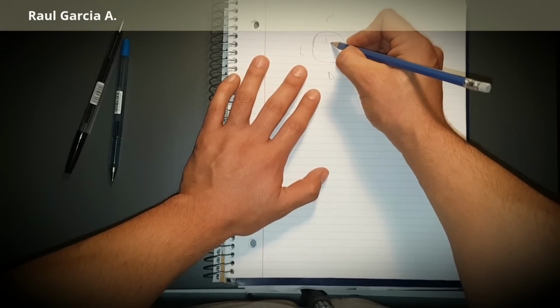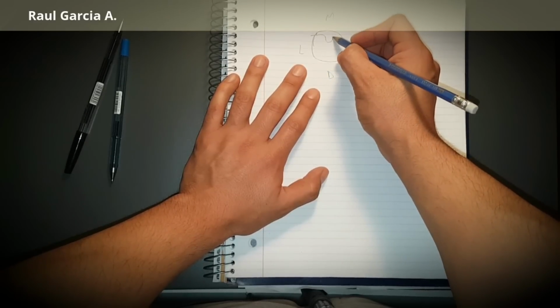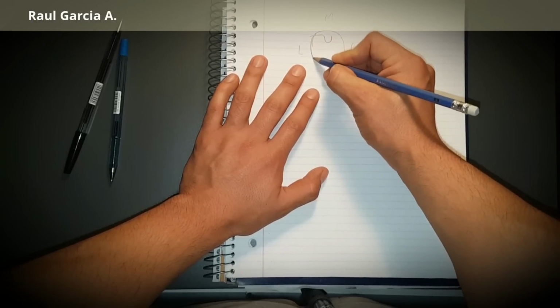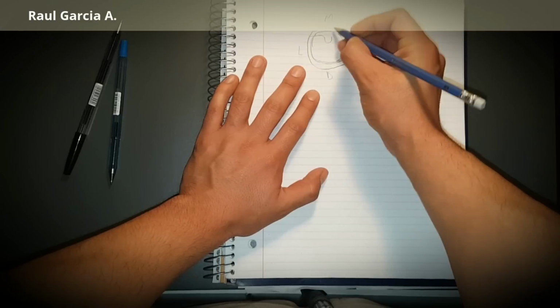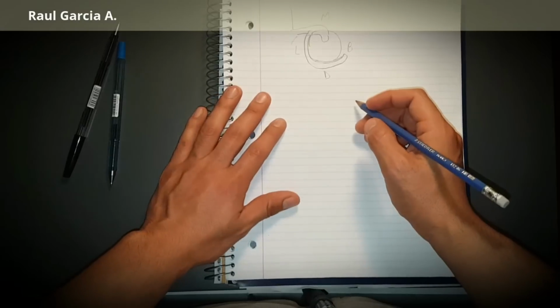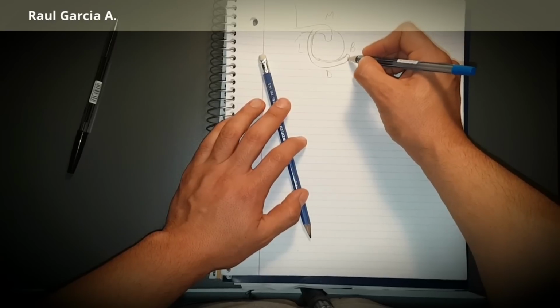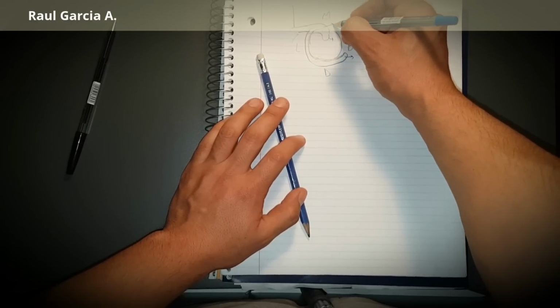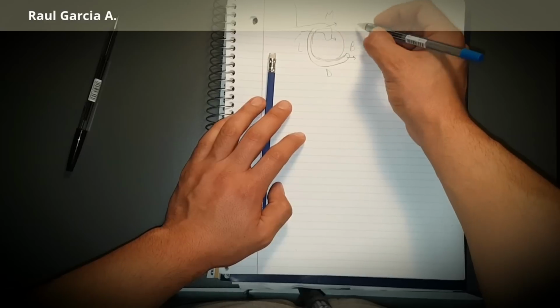It comes here from the mesial, and it comes here like this. So it comes like this and engages there, and it follows here just the rest of the structure. So what's this? The retentive arm, the rest, the guiding plane. That's the design of a back action.